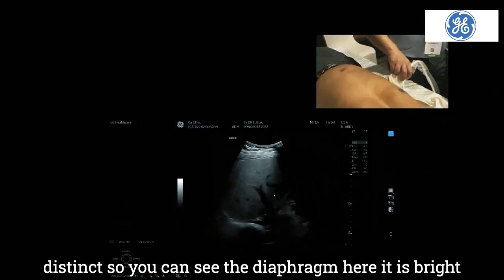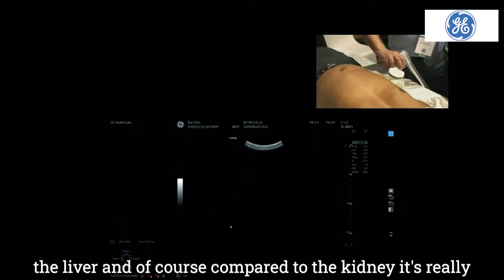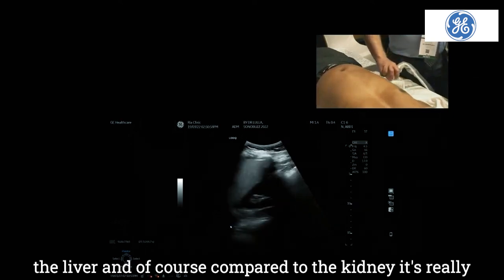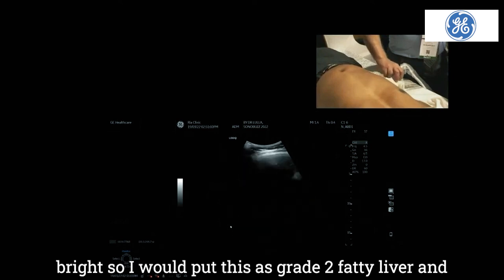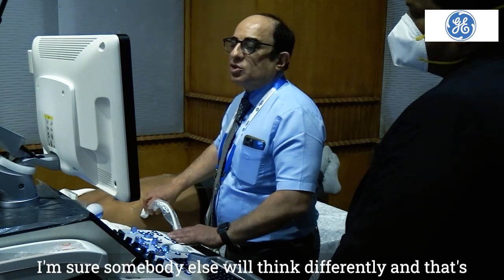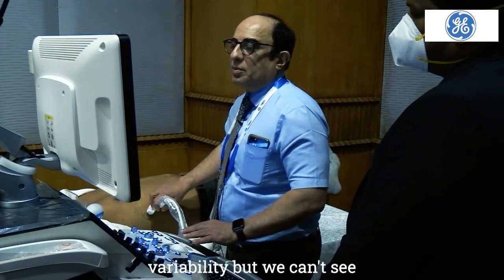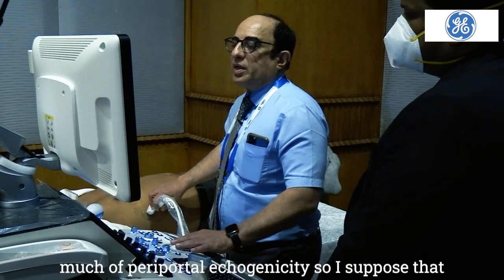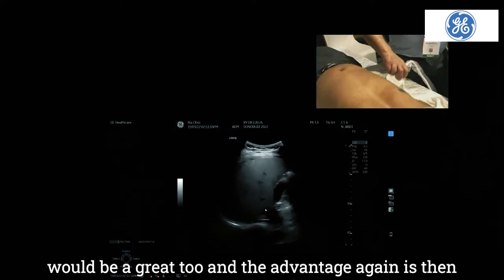So you can see the diaphragm here. It is bright, the liver. And of course, compared to the kidney, it's really bright. So I would put this as grade 2 fatty liver. And I'm sure somebody else will think differently, and that's why ultrasound has inter-observer variability. But we can't see much of periportal echogenicity, so I suppose that would be a grade 2.